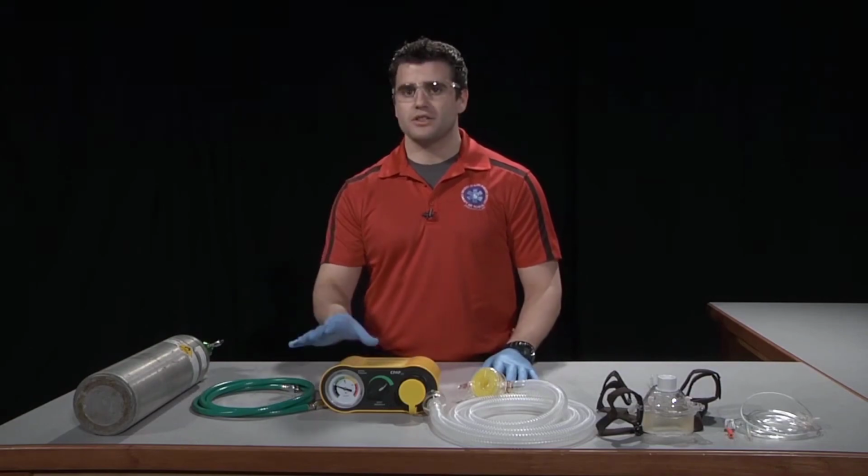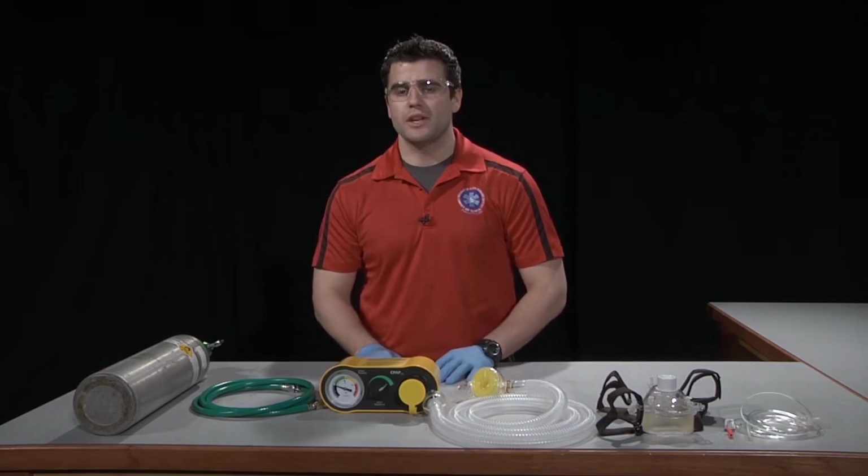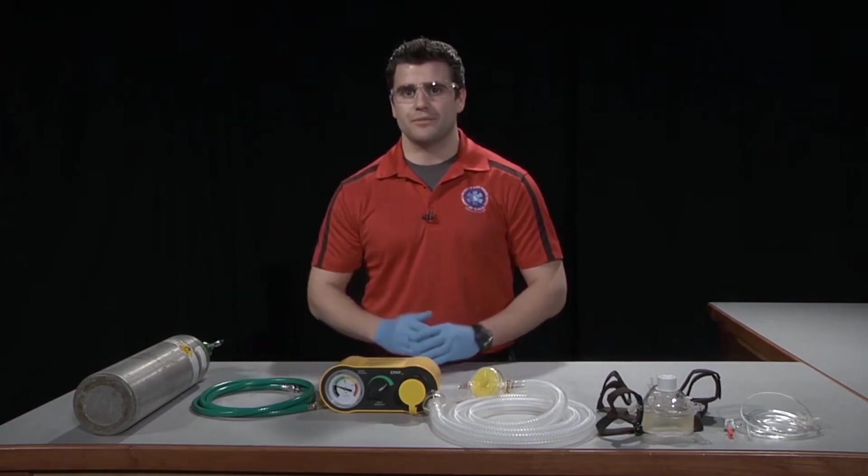We'll then attach our oxygen supply to the CPAP machine as well as the breathing portion to the CPAP machine, and then turn on the O2 in the machine. We'll then set the device parameters according to our local protocols and our manufacturer's recommendations.